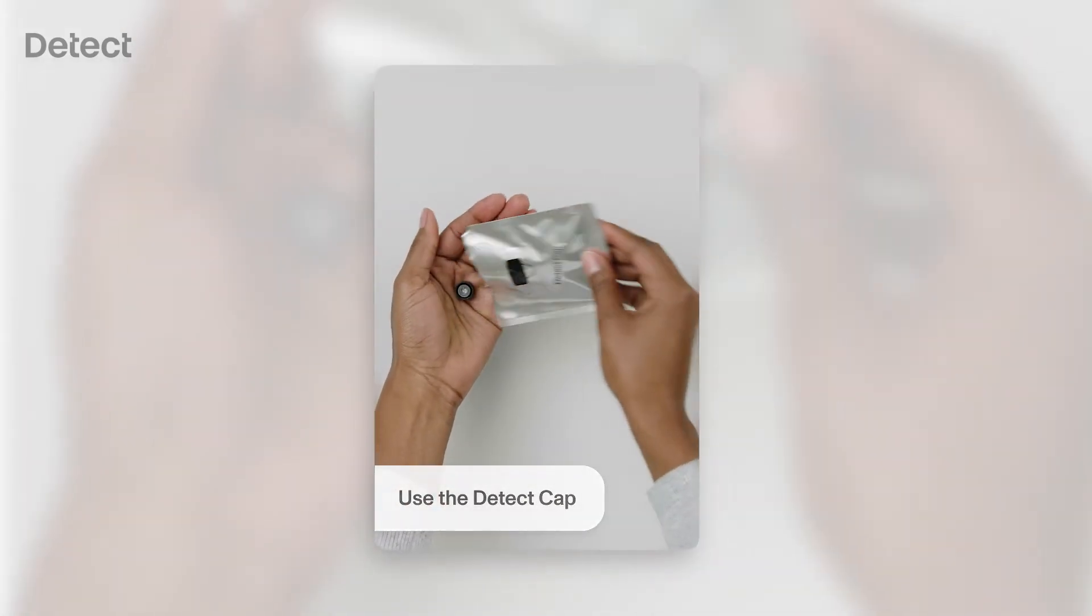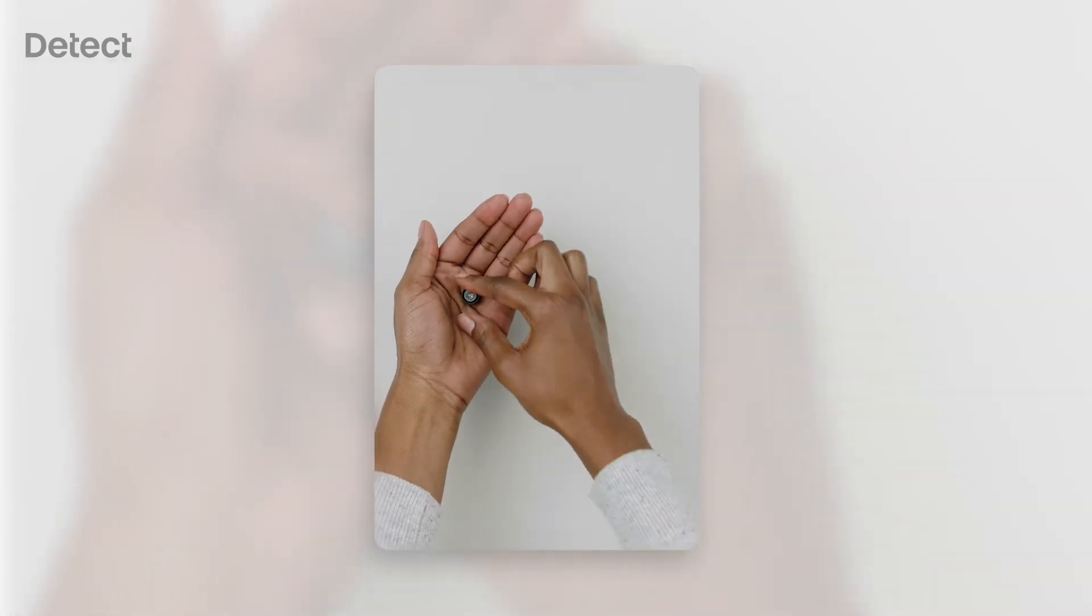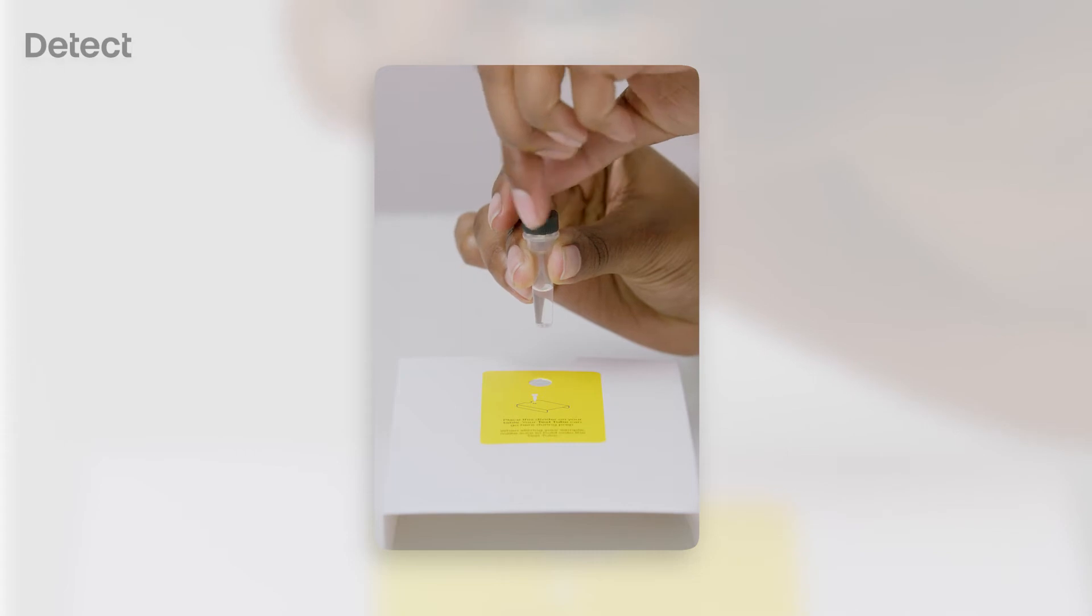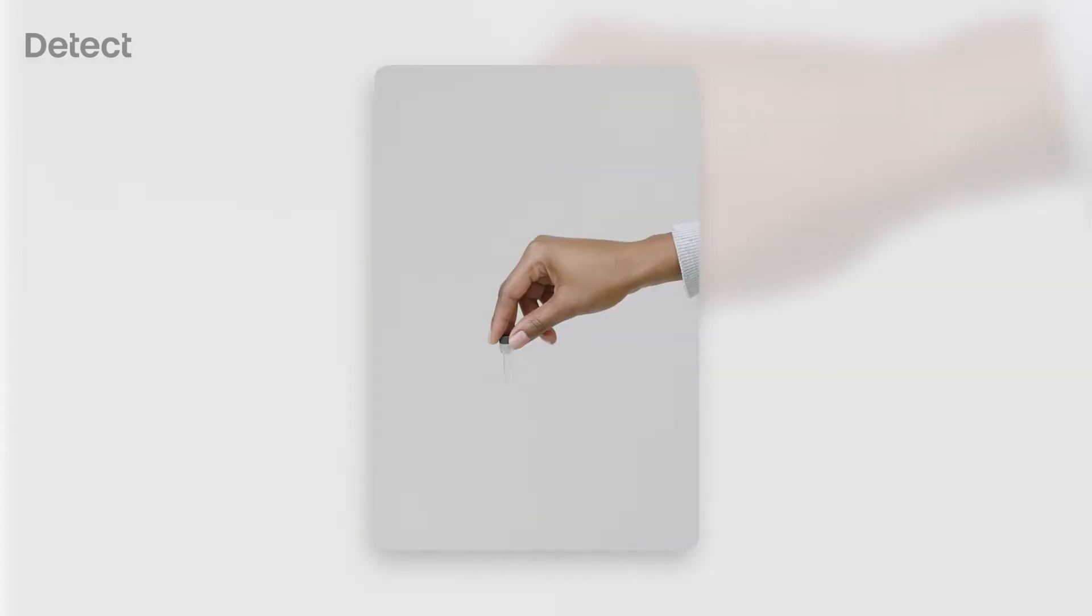Open the Detect Cap pouch. Carefully remove the cap, which contains a small reagent bead. Tightly screw the Detect Cap onto the test tube. Hold the test tube by the cap and turn it upside down. Firmly shake the tube side to side for 10 seconds. Turn the tube right side up.